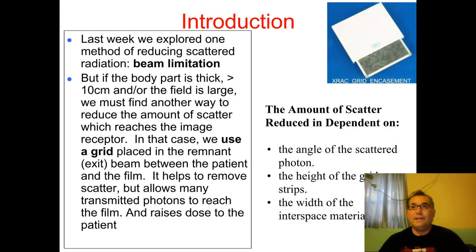And for me, the part that is pivotal is a knee. If we have a fat knee or a large knee, you might be better off getting a better image by utilizing a grid. Other than that, you can do tabletop. So for a knee, it can kind of go either way. So if we are going to do a large part, let's say a KUB or a chest, we're going to want to use a grid.